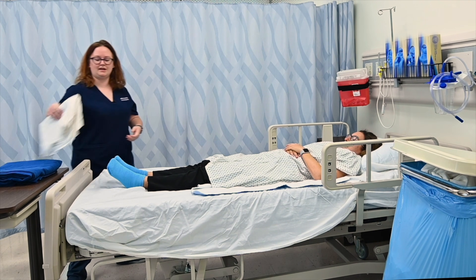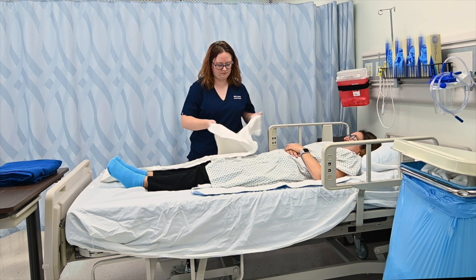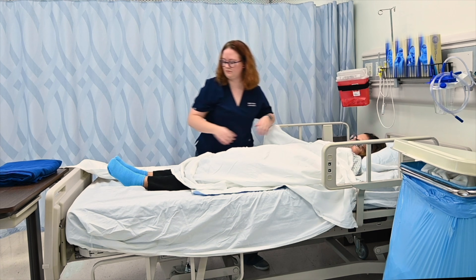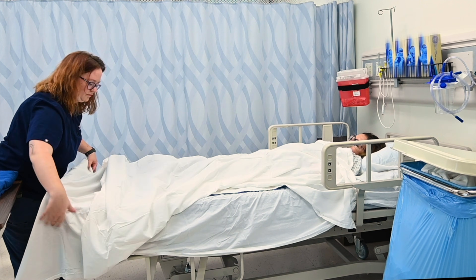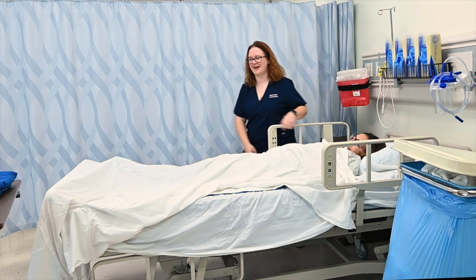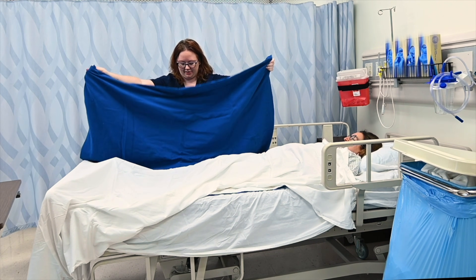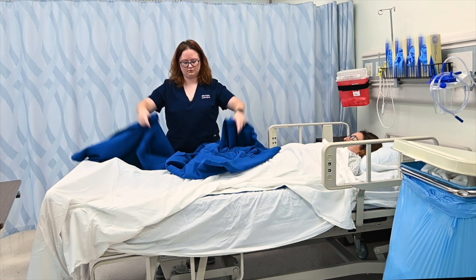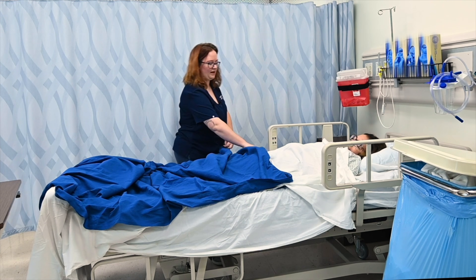Our final step is our top sheet and our blanket. I usually just hang it straight off the end of the bed — as long as it's not touching the floor, that's okay. Let's tuck you right in. I like to tuck my blanket and my top sheet together, so I'll put the blanket on as well.